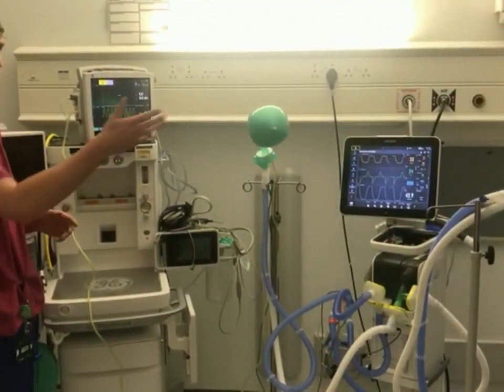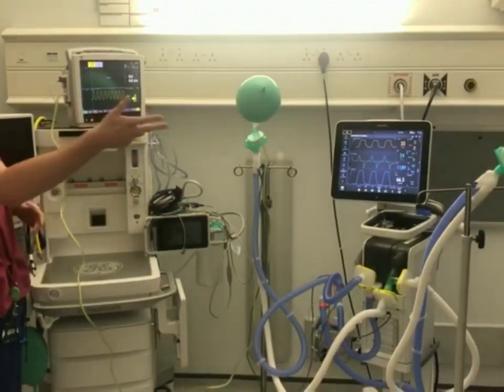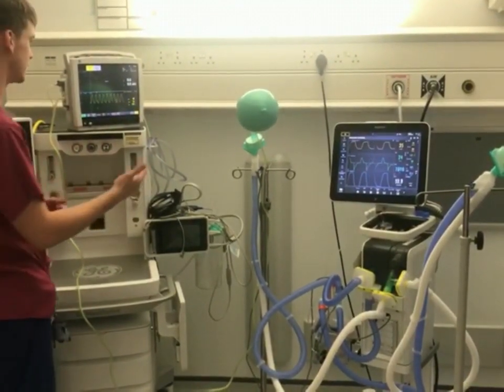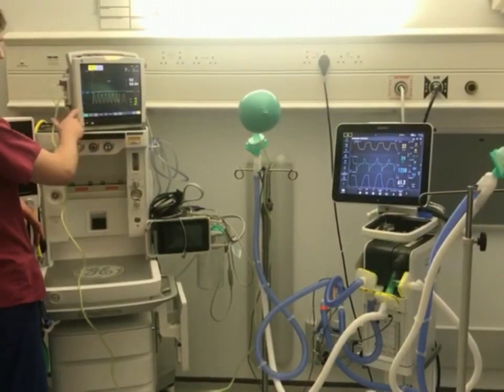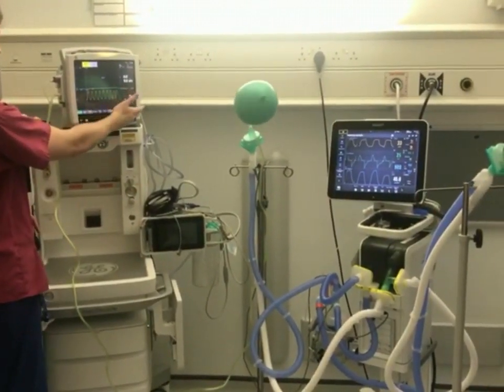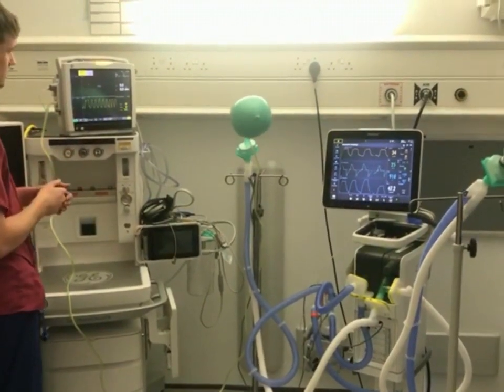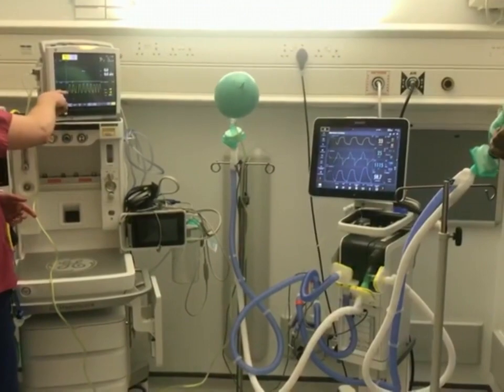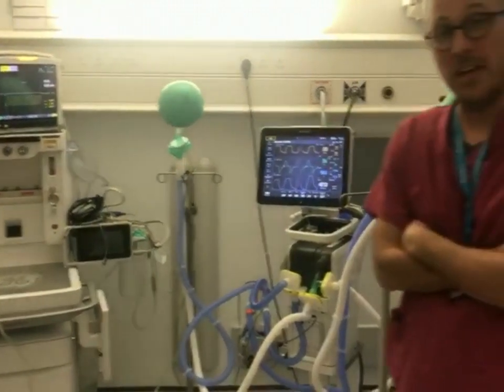So if we just squeeze one of these bags here, we can represent how, if one of the patients is having some issues, it doesn't actually affect the second half of the circuit. We've got airway pressures here, which are staying fairly regular. Tidal volumes may have just jumped up a little bit, but it's compensated already, so back down to 400. Peak pressure's the same. We've got the airway waveform here, which has stayed pretty similar. So that's all. Thank you very much.